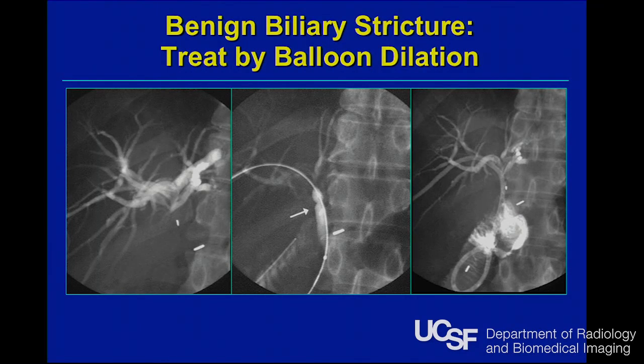And if I asked each one of you who's performing biliary interventions which way you do it, you'd probably give me a different answer. Some places advocate dilating a balloon briefly and then bringing the patient back a month or 6 weeks later for repeat cholangiograms. Some places would perform prolonged cholangioplasties, meaning they would leave these balloons up for a period of 15 or 20 minutes and then would repeat the procedure every week and actually report very nice rates of long-term patency in the range of 80 to 90%.